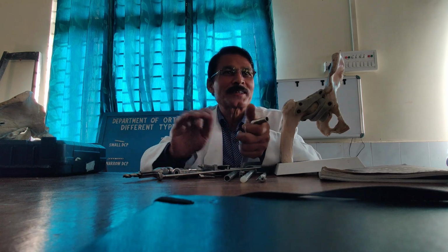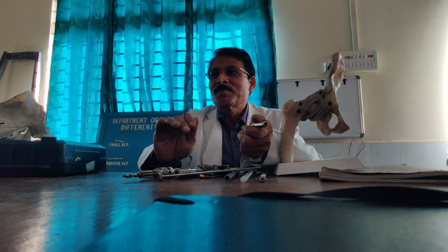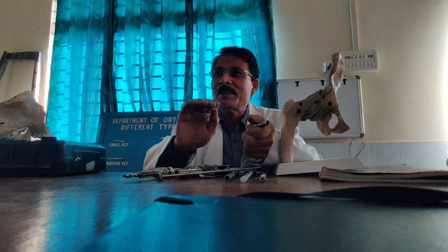Posterior inferior is more acceptable to variability because there is a long area of cut through. Posterior inferior is more acceptable. Variability is there, but ideally it is central. Yes, sir. So step by step, if you are going like this, now these are the principles. Any question? Regarding technique, these are the principles.